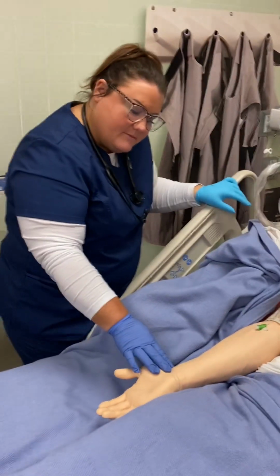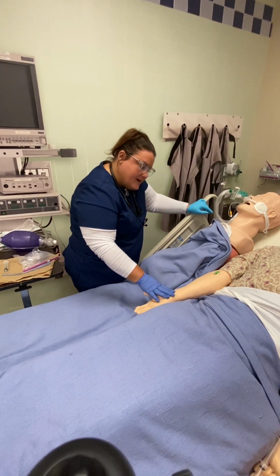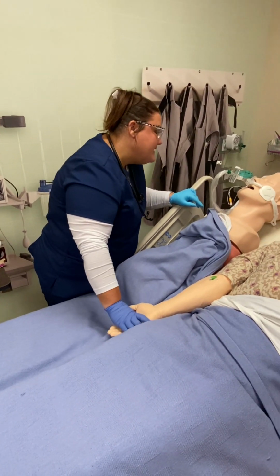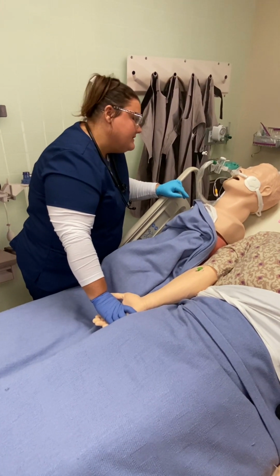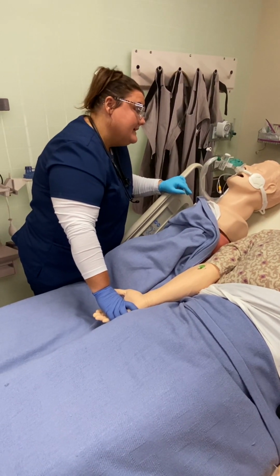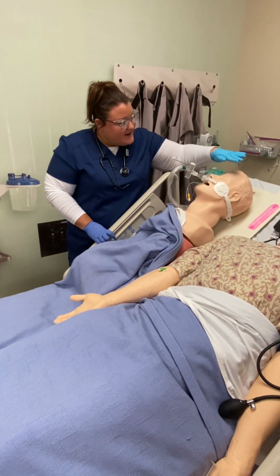Okay, so I'm going to look at his ID bracelet. I'm looking at his name, his date of birth, and his MRN number. And I'm gonna check his level of consciousness. Is your name John Smith? You can squeeze my hand. Great, okay. And is your date of birth 8/15/72? Great, okay. And are you ready to get that tube out today? Okay. So can you lift your head to my hand right here?